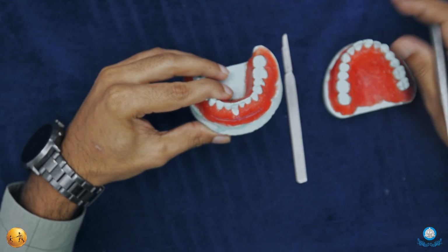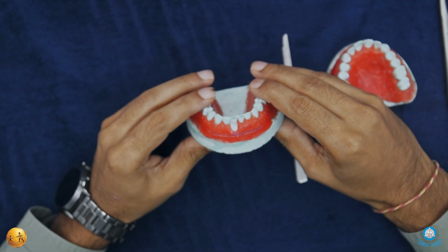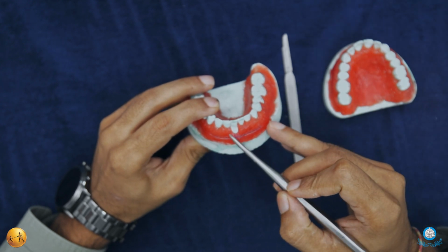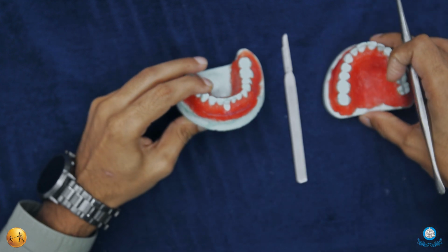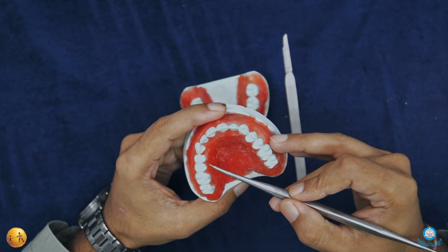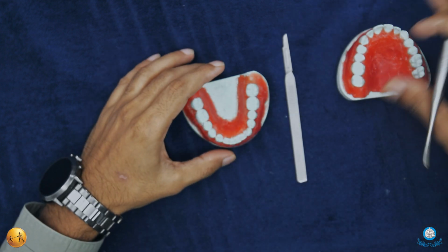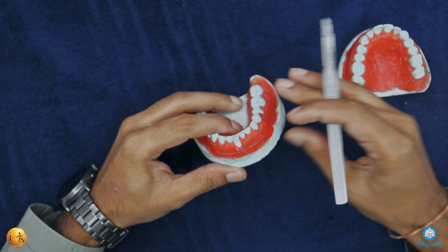Okay, so most commonly, there are 4 steps that are involved in the free gingival graft technique. First of all, we will be preparing the site for receiving the free gingival graft. Second would be to harvest the free gingival graft, and the most common site for that is the palate, distal to canine up to the first molar. So the first step would be preparation of the recipient site.